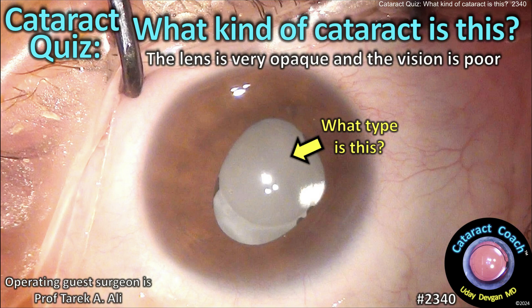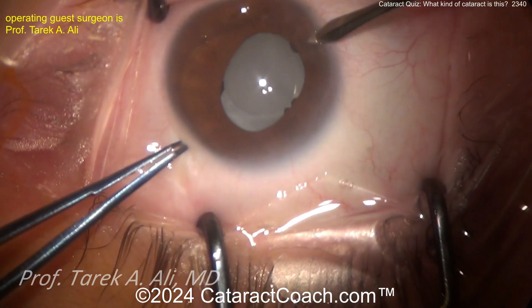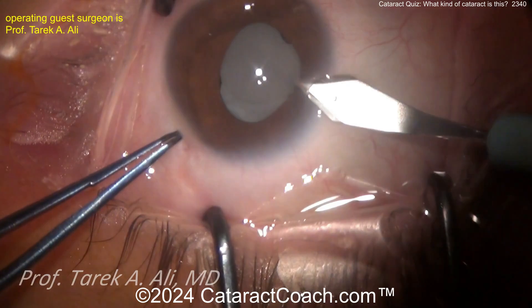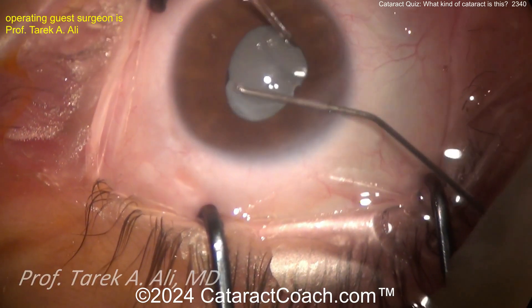Cataractcoach.com cataract quiz — what kind of cataract is this? Look very carefully. That lens is very opaque and the vision is very poor. Have you figured it out yet? Look carefully — what do you actually see? There's a capsule edge. This is not a cataract; this is an opaque IOL. So this patient needs an IOL exchange.